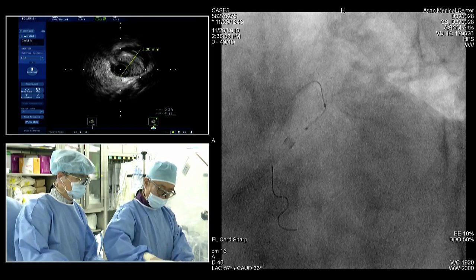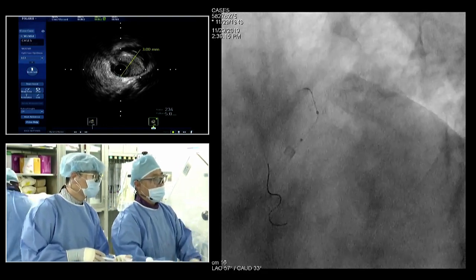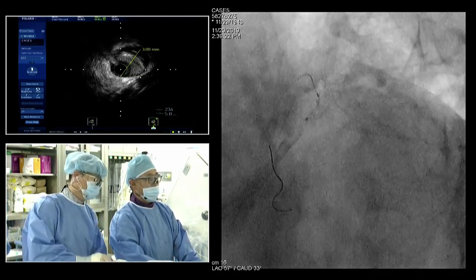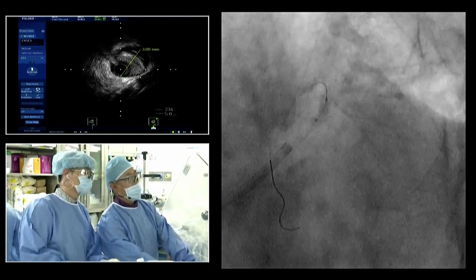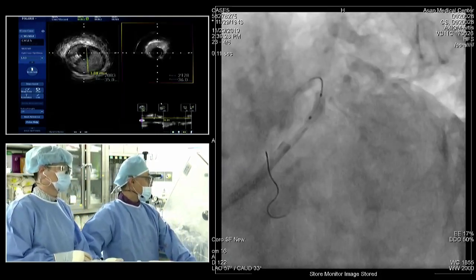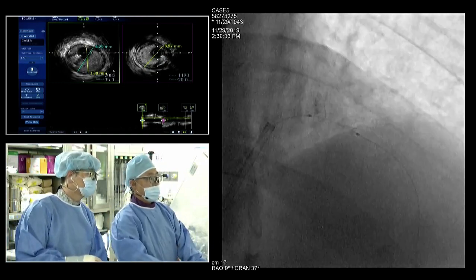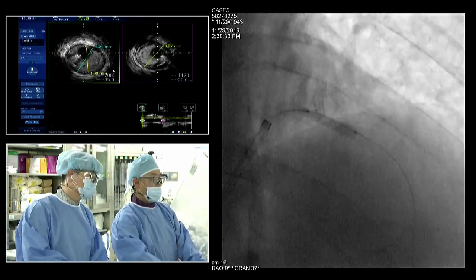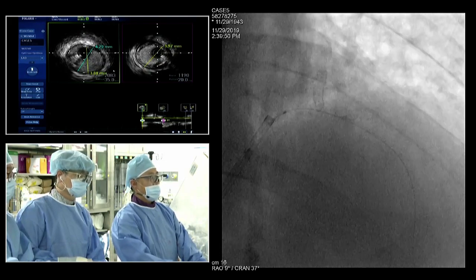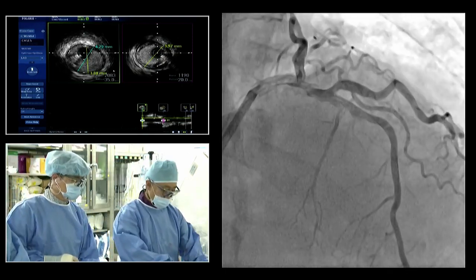Dr. Lefebvre, do you have any preference for a specific stent to treat the distal left main? Difficult to answer this question because today I think the majority of stents are okay with the left main. I think there is a new one which is coming, Megatron. I don't know if you have experience with this stent from Boston Scientific. The stent has a very high radial strength, so for the ostium of the left main, I think it's very good as compared to stents where you have only two crowns, two connections. I think three connections are better for left main, and there are four with the Megatron.